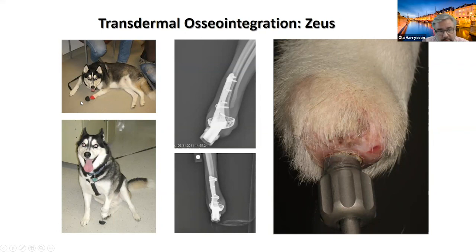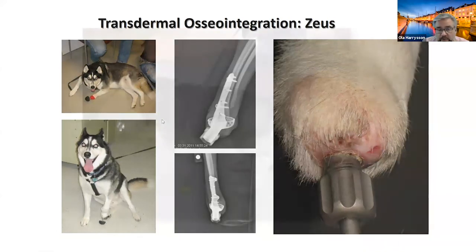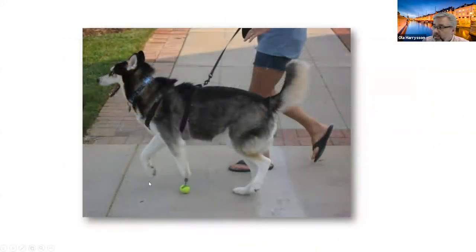The first prosthetic paw that we made was also 3D printed out of a rubber material. It worked well, except when you're walking outside on pavements, it will wear down very, very quickly. So we found a solution to that: we used a tennis ball at the end of that prosthetic paw, and it actually works very, very well for the patient.